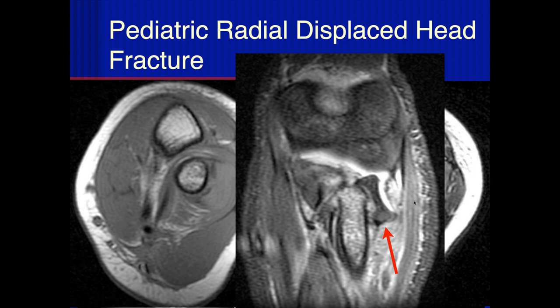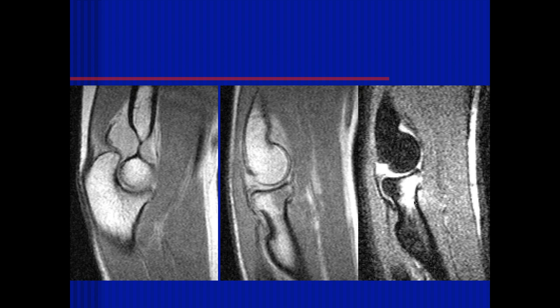You might need some Chinese finger traps to put some tension on it. Chinese finger traps on the fingers and thumb. Okay. And then put some pull on the arm with the forearm straight up and the traction on. And then you just push on the radial head and it'll pop back in. Okay. Usually. Not necessarily every time. But the only reason it wouldn't go back in is if there was some tissue interposed, and I don't think there is any.